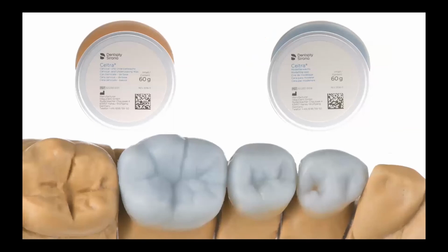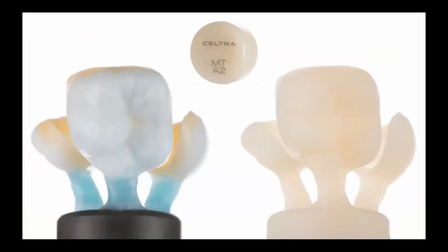But in terms of aesthetics, it's quite a difficult way to achieve the light reflecting surface of the restoration. So I can replace this white thin film of stain with a thin film of white veneering porcelain. When I make the wax of my restoration, I reduce it slightly, by 0.1 millimeter. And for pressing, I use ingot MT A2 for the shade A3, for example, or A3.5. So there must be a slightly brighter ingot.